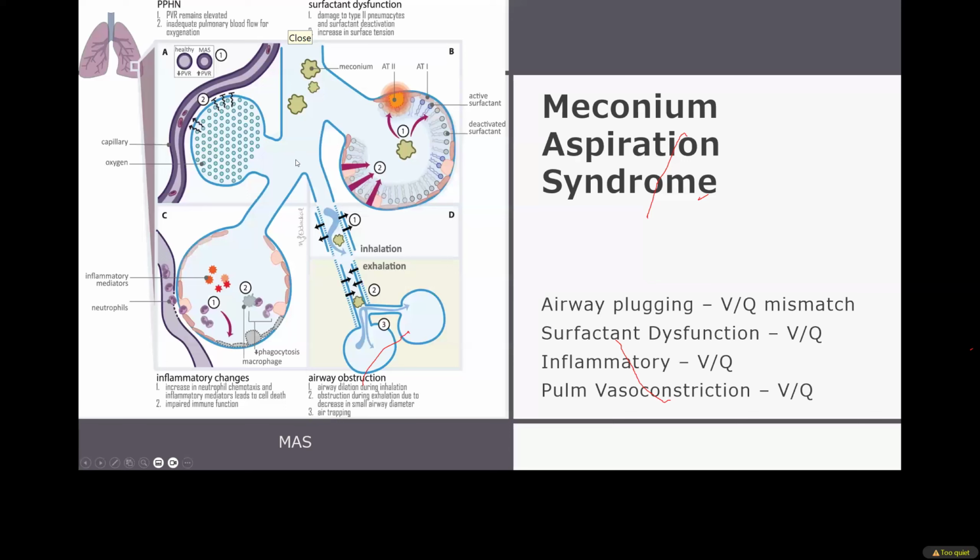But the third part of this is the pulmonary hypertension part. And with the high frequency ventilator, you can go up on the pressure quite a bit and not have to worry about volume trauma. And most people use high frequency ventilator with a good amount of oxygen and quickly move to nitric oxide if you're not able to ventilate properly because of the VQ mismatch due to pulmonary hypertension, where the blood flow to the lung is compromised and you have a VQ mismatch and the babies get deoxygenated very easily.